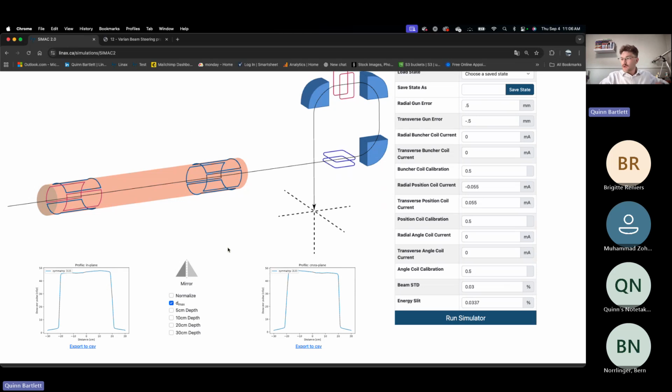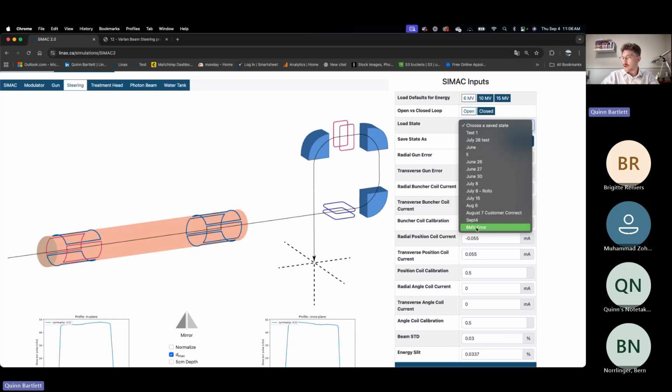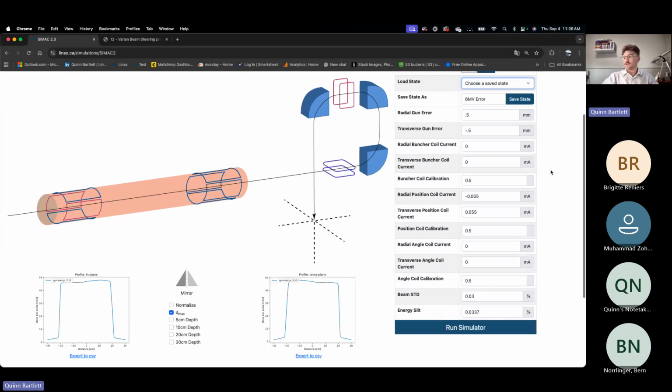Okay, so I'm going to save this state. Why don't we call it our 6MV error, so we'll call it our error run. I'll save that state, and I'll just confirm in my save states. Okay, so we saved it, so that's good. Now we can change things, and then we can always come back to that state when we need to. So now what we want to do is correct our asymmetries.